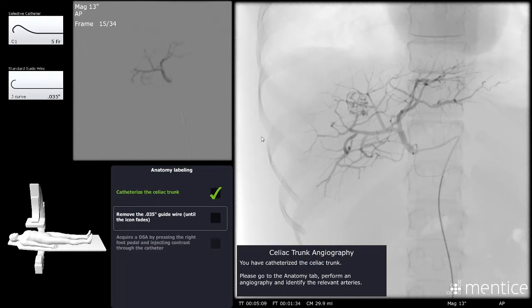Okay. So in this scenario from here, I would probably take a microcatheter microwire. I would certainly interrogate and probably come up this artery and do angiograms. And I would also check this one on the way out and do angiograms to just see if there was one supply, dual supply, or if there are any other arteries. This is where your interrogation of the lesion is very important, because that will determine your likely success for treatment of this lesion. Because if you leave any open arterial branches, this tumor will just recruit vessels from that site and from other sites, and you won't get a proper treatment.